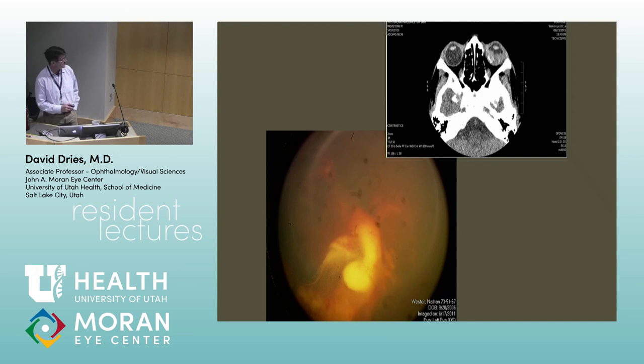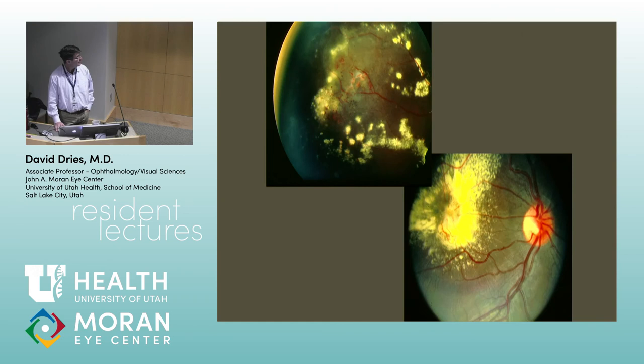So this? If I saw that in the clinic, and someone said, what is that? I'd say toxocariasis, retinoblastoma, occult trauma with an intraocular foreign body. I mean, there's just no way of knowing what that is, but the CT shows us calcium, so it's retinoblastoma.